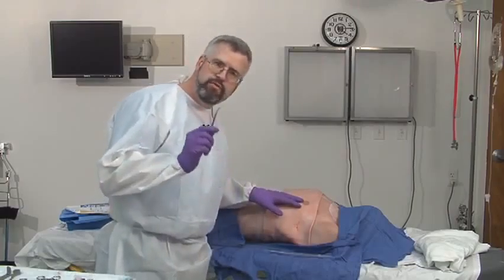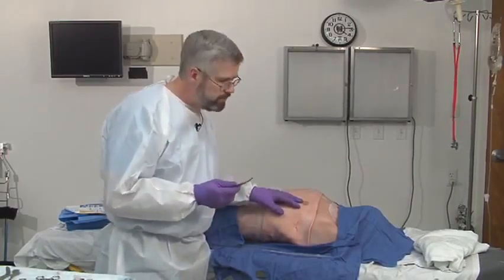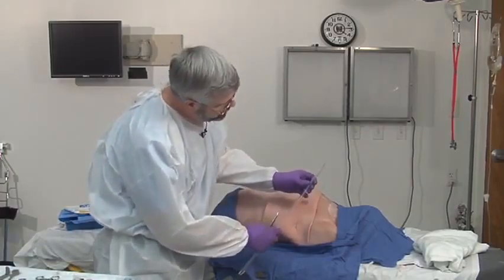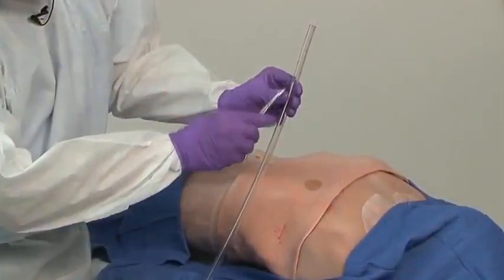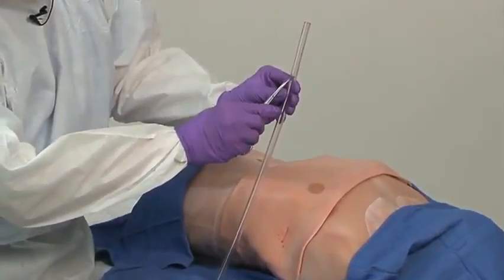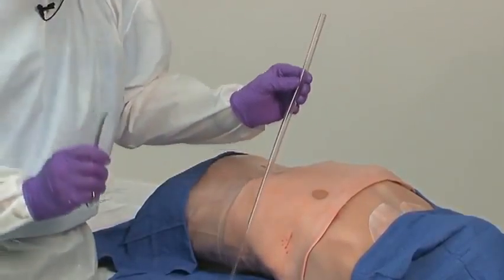Because we're suspecting in trauma that there's blood, we always want to use a fairly large tube, at least a 36 French tube. And if you look, the chest tube has several holes in the end of it, and that last hole breaks this white line. This white line shows up on an x-ray, so if you look at an x-ray, you can tell where that last hole is in relationship to the skin.